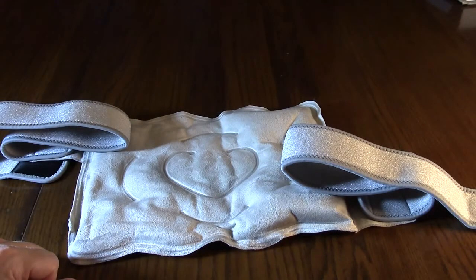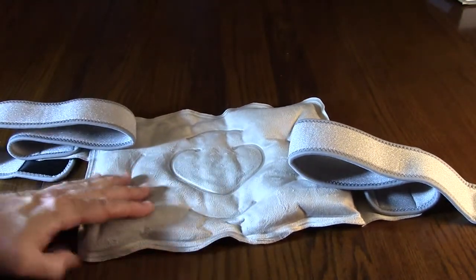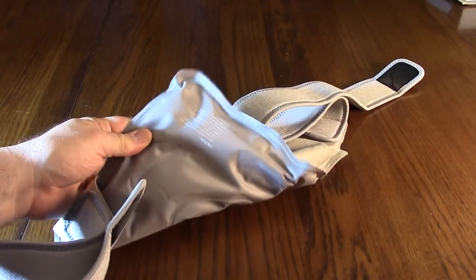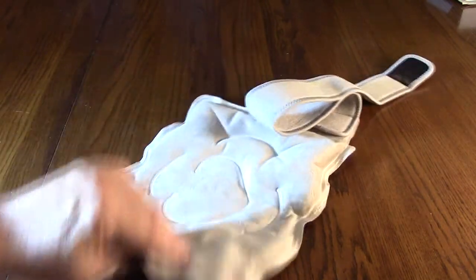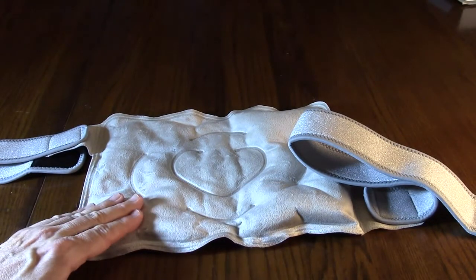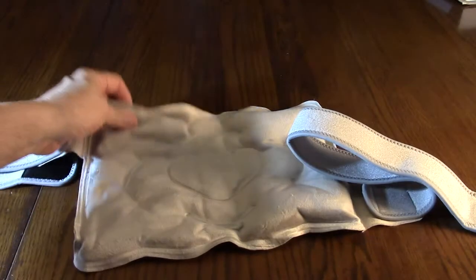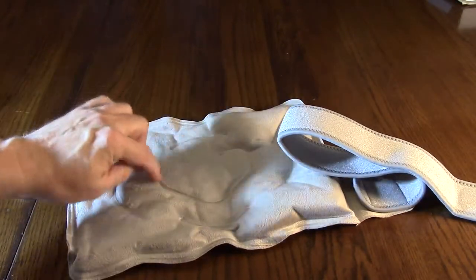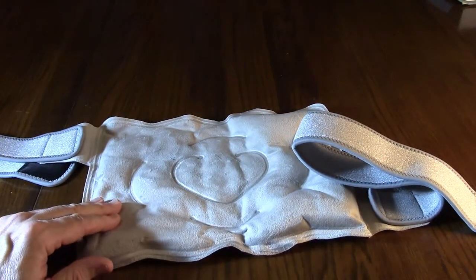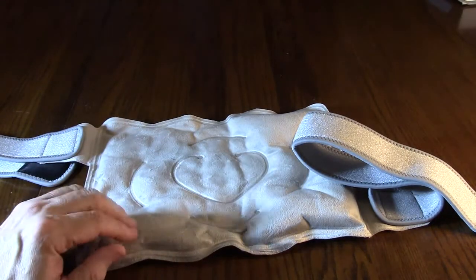Let's take a closer look at the construction. Here is the velvety side that's going to go against your skin, and then this side is the shiny vinyl-looking side. The gel is dispersed in little pockets that separate it into different regions, which is smart so that one section cooling down or heating up doesn't affect the other — there's kind of an isolation effect in there.